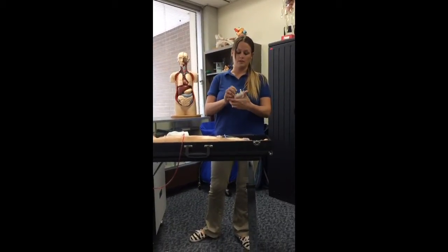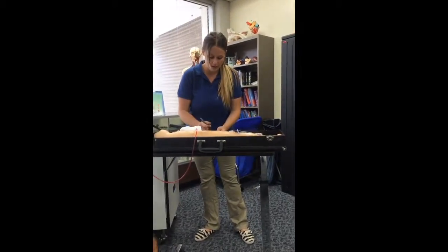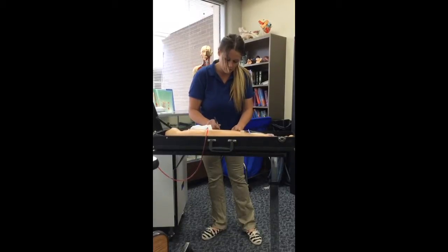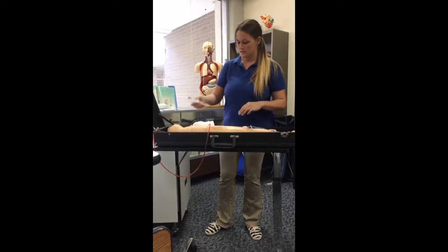I'm going to take my label, put it on the back of my bag, and I'm going to document the drug, the amount, my name, the date, the time, the expiration date, the patient, the room number, and the start time. Then I'm going to set this to the side.